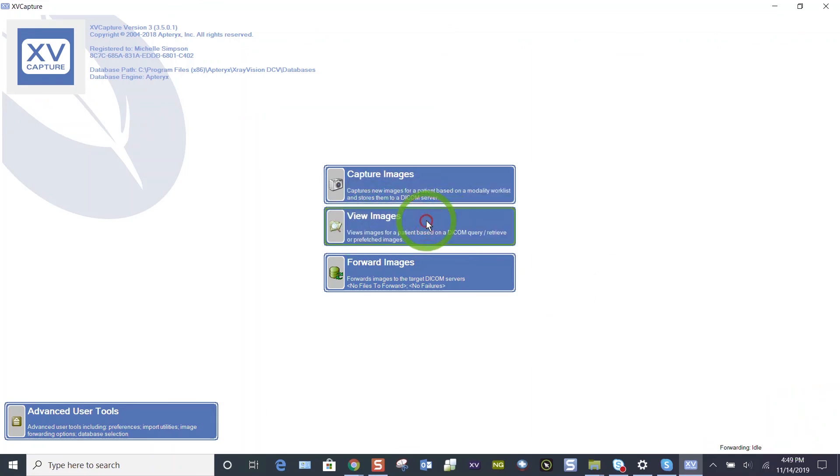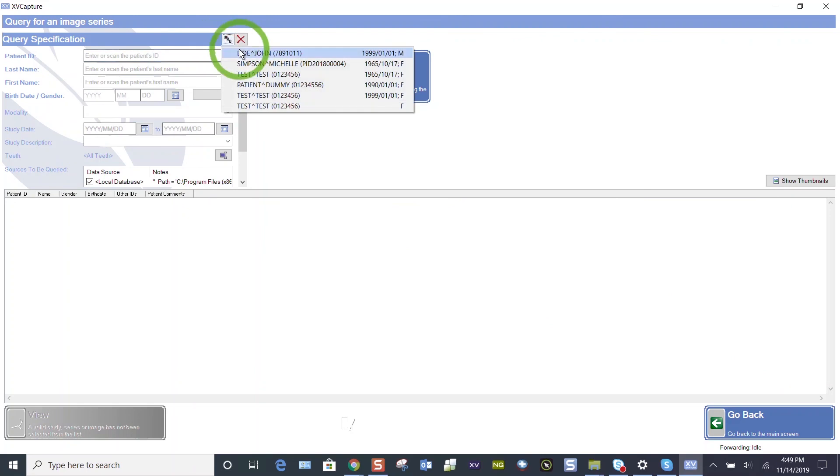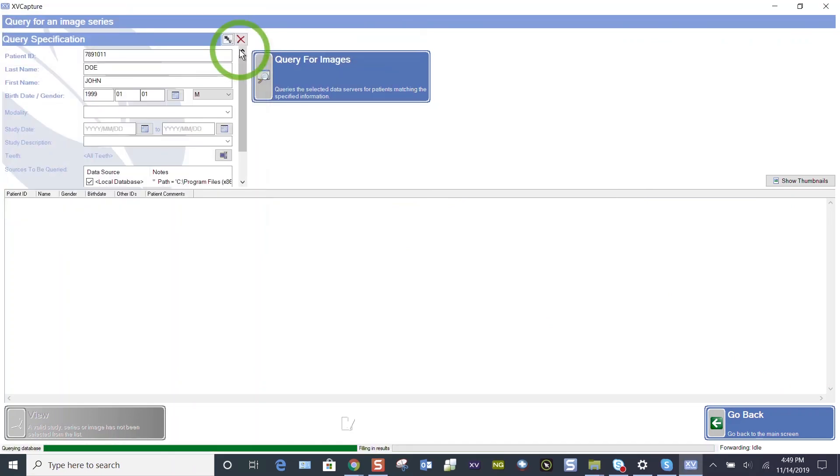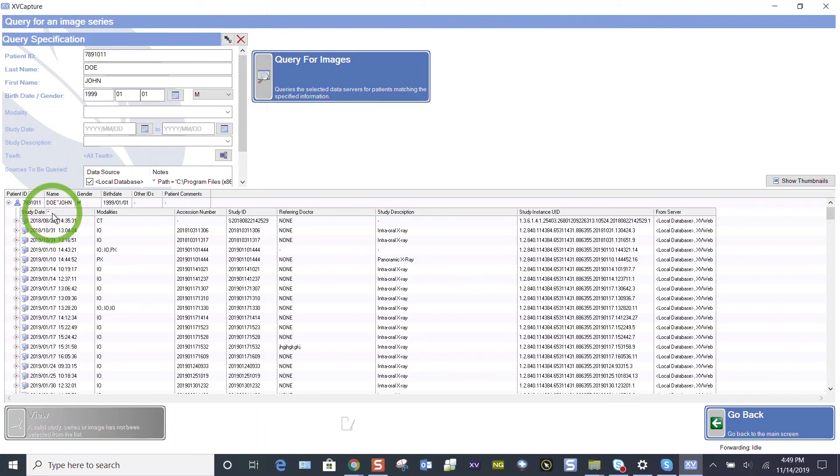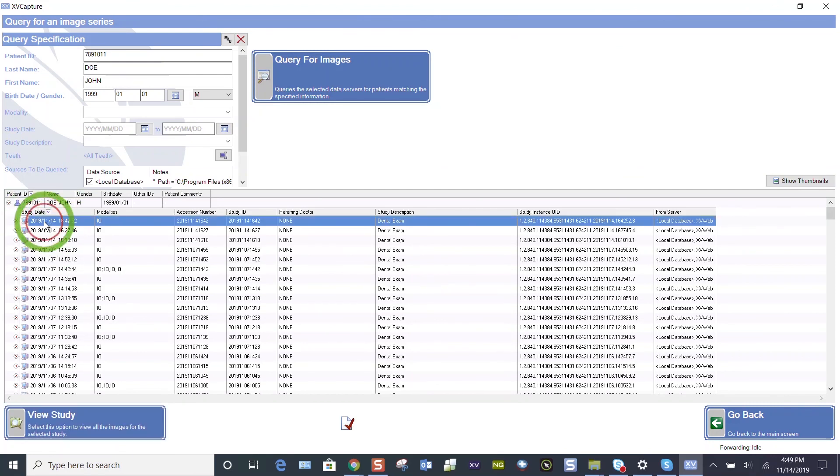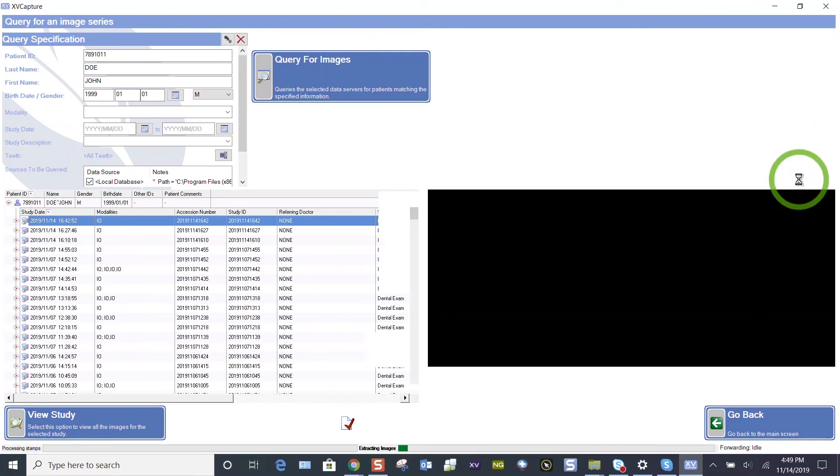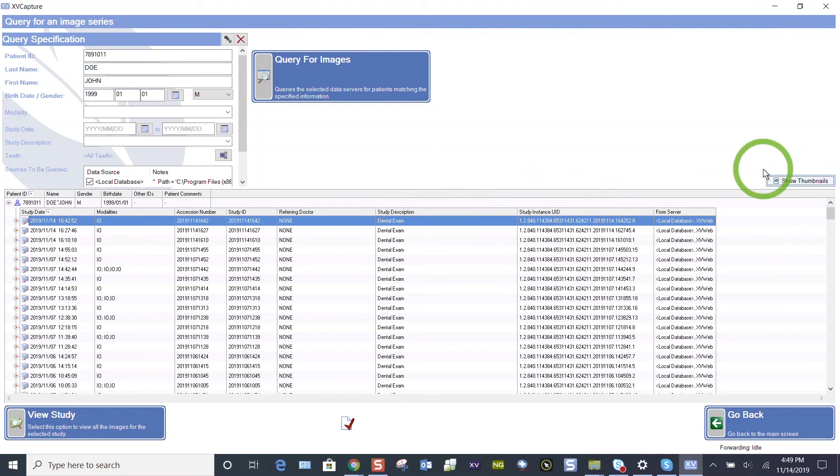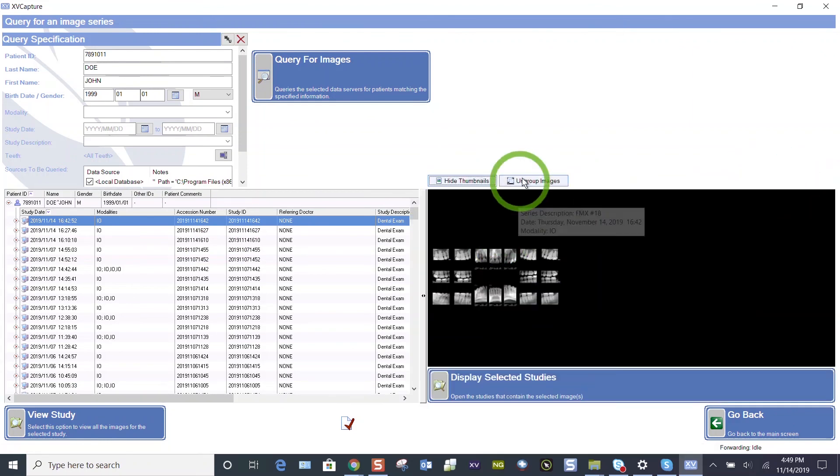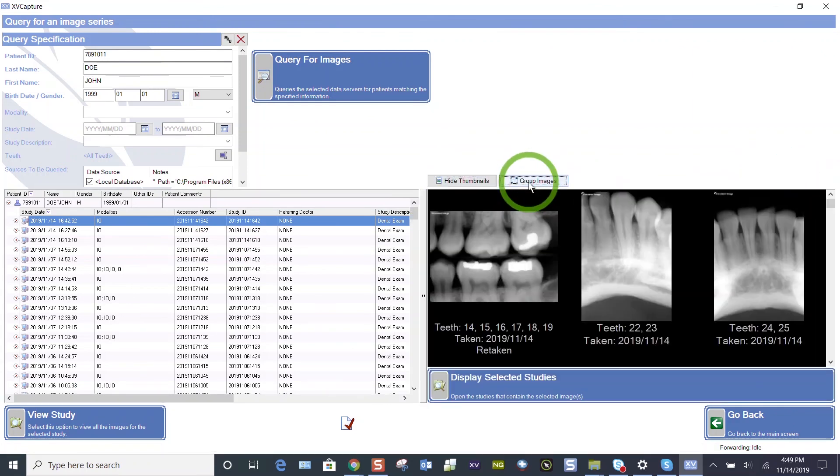View images when you bridge over from your practice management software, your patient's name will auto-populate. Let's just pull in John Doe. And so here's the dates of acquisition. You see the small arrow above study date that rearranges your most recently. Now it's August 22nd. Click that again. I'm on November 14th. So whether I choose to show my thumbnails or not, also your images may come in ungrouped. They may come in like this.